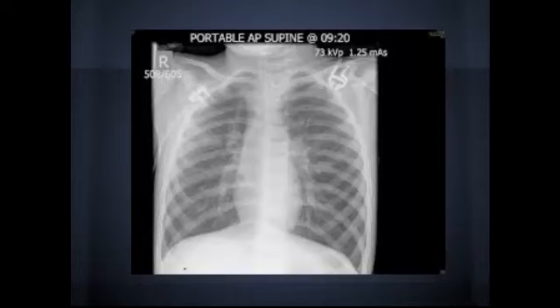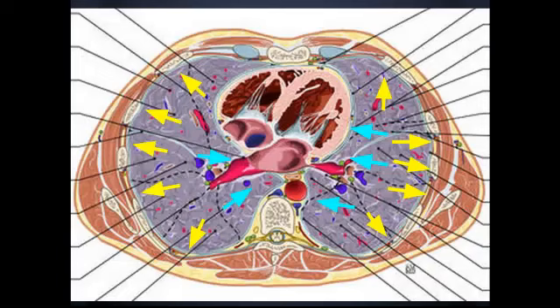The main concern is that a ventilated asthmatic is auto-peeping, which happens when there's an incomplete exhalation before the next breath starts. So we're not doing a good enough job allowing them to exhale. And what happens is the air builds up and keeps building and building after each breath and causes hyperinflation of the lungs. And eventually, it pushes not only outward but inward, increases the pressure on the IVC and decreases venous return, and therefore can cause hypotension and even arrest in these patients.